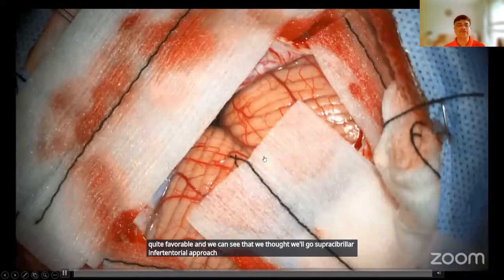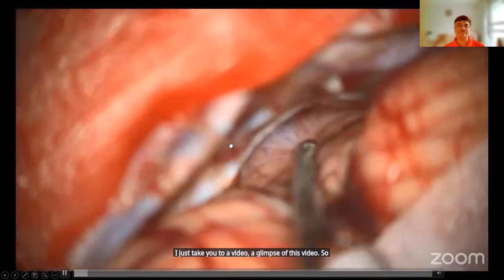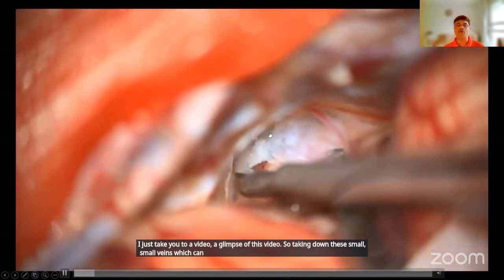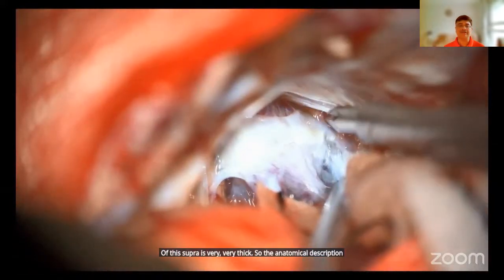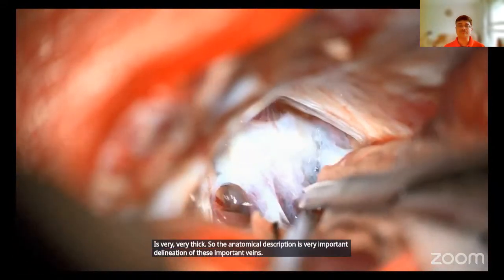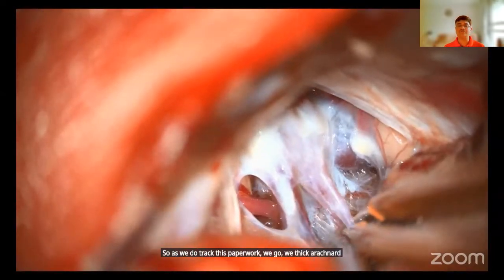I'll just take you through a glimpse of this video. So, taking down these small veins which can bridge, and then we open the arachnoid. The arachnoid of this supra is very, very thick. So the anatomical description is very important, delineation of these important veins. As we track this superior part of the vermis, this thick arachnoid has to be opened, and then you see these beautiful venous structures.